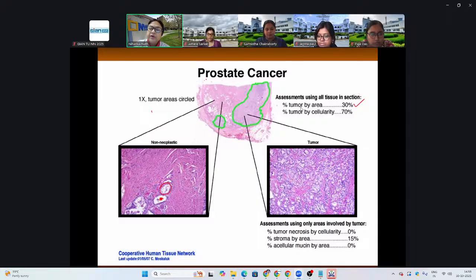You count the intensity of the dye. This is now a tumor, so you don't just have abnormal cells or dysplasia. You have full-on growth. So you go by area, and then you also have to count the individual cells. You can go by area in terms of intensity, and you can also go by cellularity, take locations and literally count the cells over total cells.